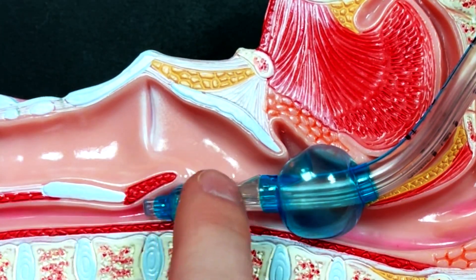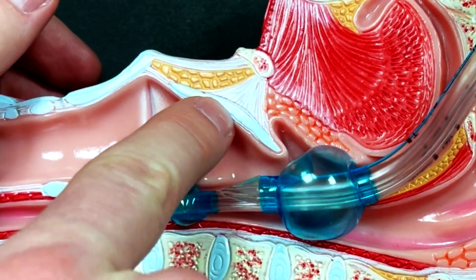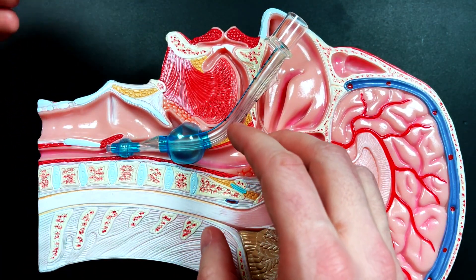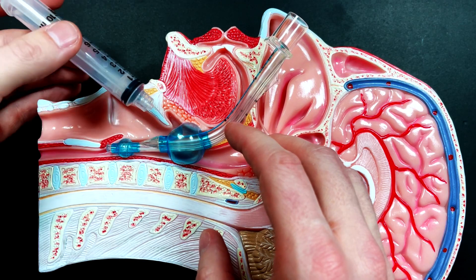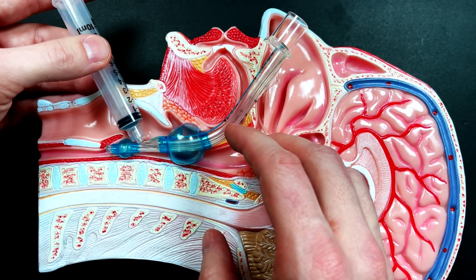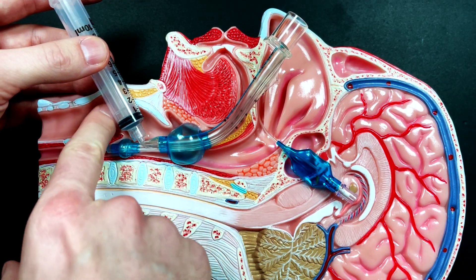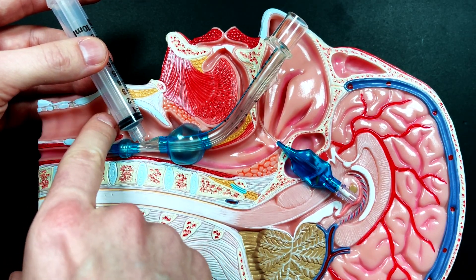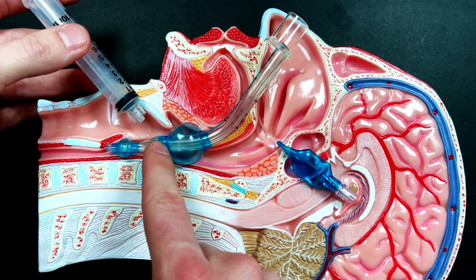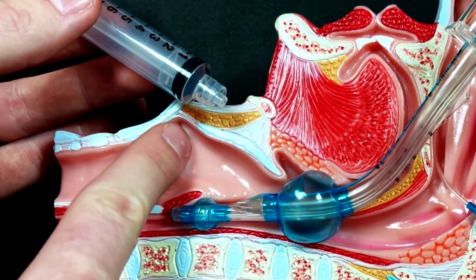what you'll notice is that this is the epiglottis right here. Now in epiglottitis, likely what's going to happen is that it looks more like this and it's probably sitting like this — so it's probably just about totally occluded right here. The whole issue with the supraglottic airway is that you're not getting past the obstruction, because it's the glottic opening right here.